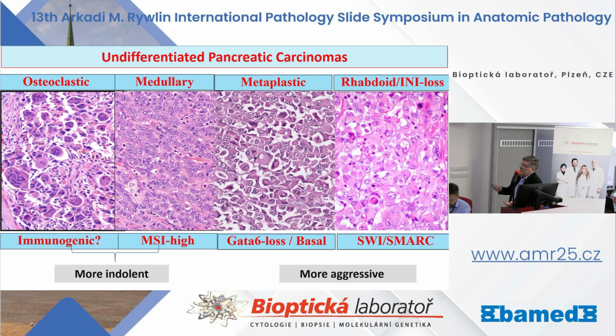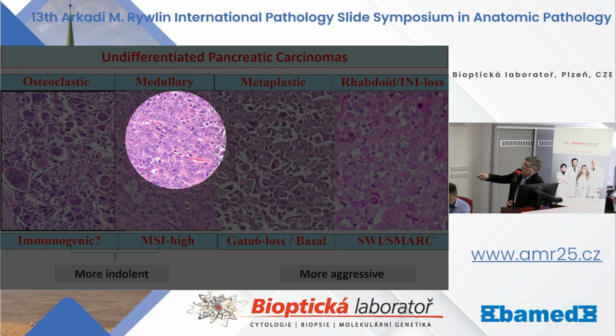Medullary carcinoma, just like those in the colon and ampulla, is MSI high, and they are very rare. If you see one, it's most likely ampullary origin rather than pancreatic origin, but they do occur in the pancreas, even in the tail, very uncommonly, and they seem to have better behavior, just like in the colon. Their features are more solid, their cytology is distinctive, with lymphoplasmacytic infiltrates.